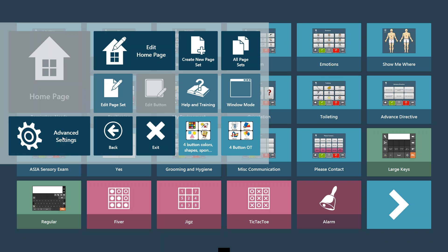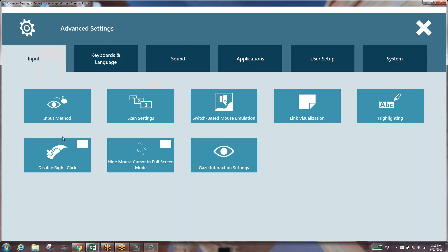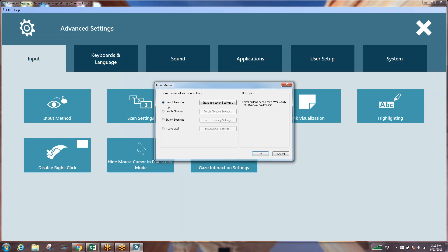So we go into our advanced settings, and we'll see that we want to initially start with our input method, and we want to verify that we currently have gaze selection turned on. If you had touch selection or switch scanning turned on, you want to make sure you have gaze selection or gaze interaction turned on.